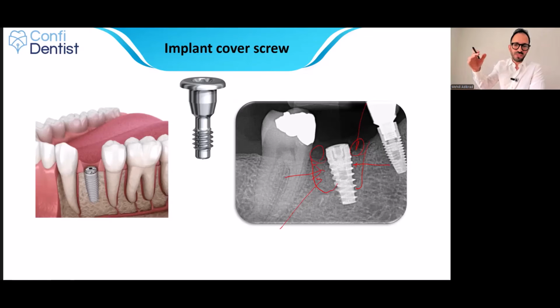So the implant was placed immediately and the socket was grafted with bone particles. And then it was covered by the tissue, but you can see we already have some thread exposure, some bone loss. Okay. The adjacent implant is also bone level, but I have some bone loss.